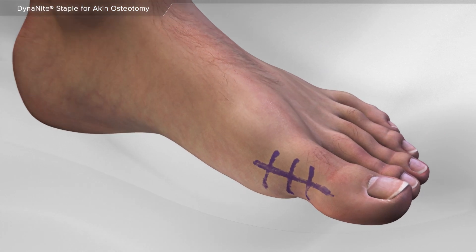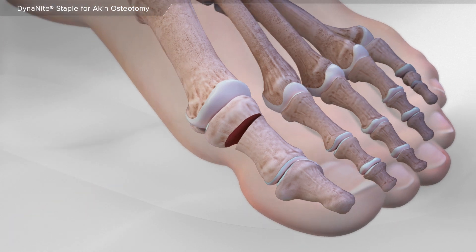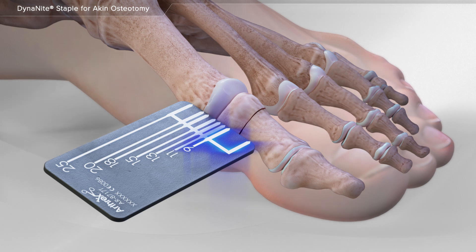First, your surgeon makes an incision over the side of the big toe and then removes a small amount of bone to realign the toe. A sizing guide is used to determine the correct size of the dynamite staple.